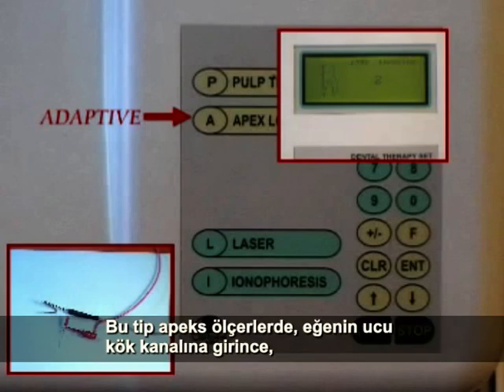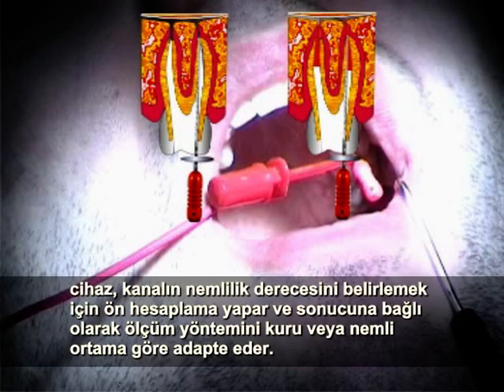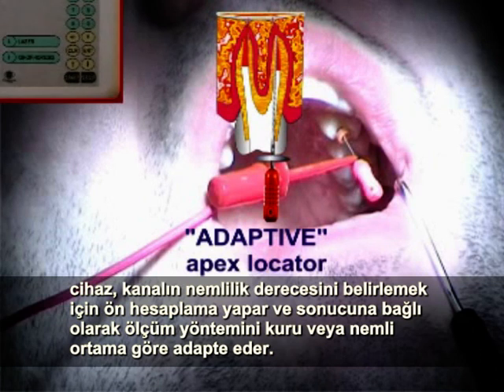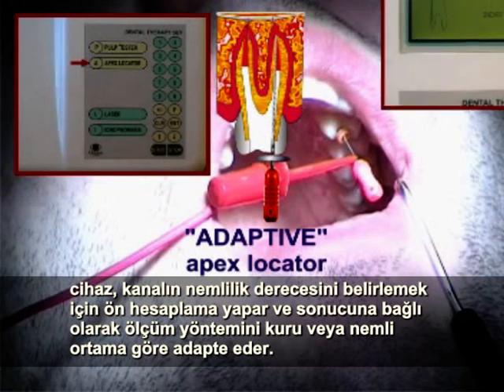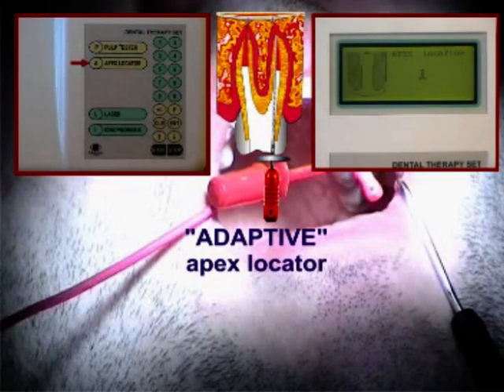For this type of Apex locator, on inserting the tip of the file in a root canal, the device makes a set of preliminary calculations to determine the degree of humidity and, depending on it, adapts the method of measurement for a dry or wet canal.